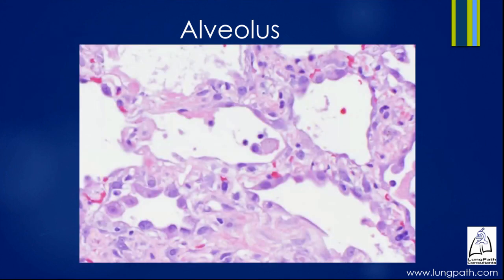This is an example of an acute injury in the phase where the epithelial cells are proliferating, the type 2 cells are proliferating, and you can see them lining these spaces as hobnail, quite atypical cells. These cells are important to recognize because they simulate adenocarcinoma. This is one of the places where pathologists can have great difficulty distinguishing reactive atypia from neoplasia.